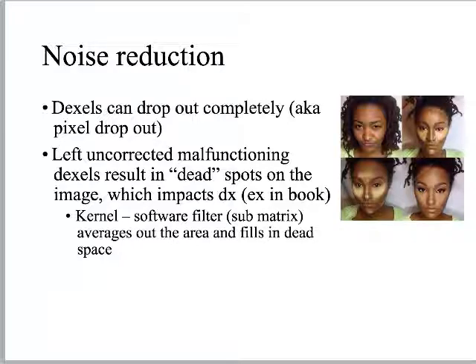He talks about this kerneling operation here. And what he says is there's just some normal wear and tear that happens with our image receptors. And to correct for that normal wear and tear, we are going to average the areas around it.